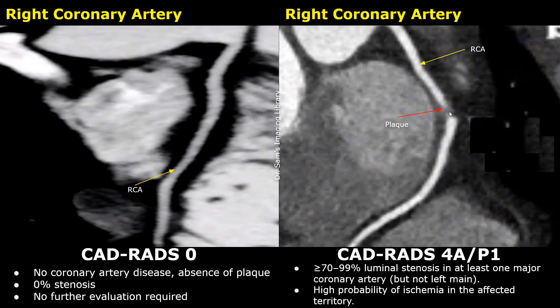In this image, we see a plaque in the right coronary artery causing a severe stenosis that seems to be between 70 and 99%. We can see most of the lumen is obstructed, and only a very thin, bright line is visible. The artery enhances normally distal to the stenosis. So this is classified as CADRADS-4A because there is severe stenosis in a major coronary artery. The other arteries were normal.